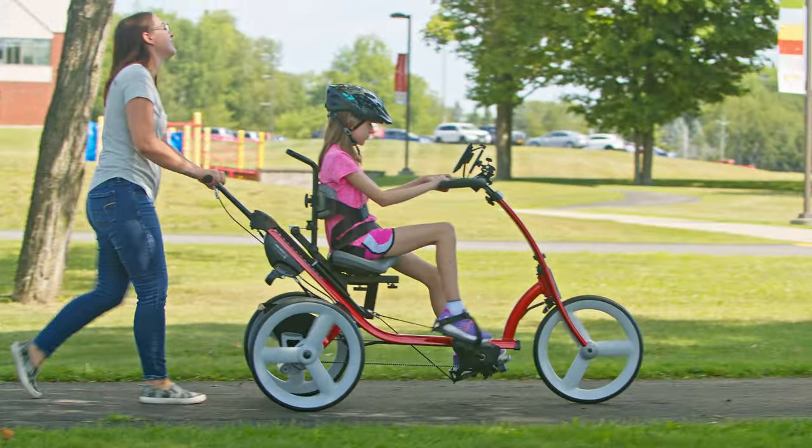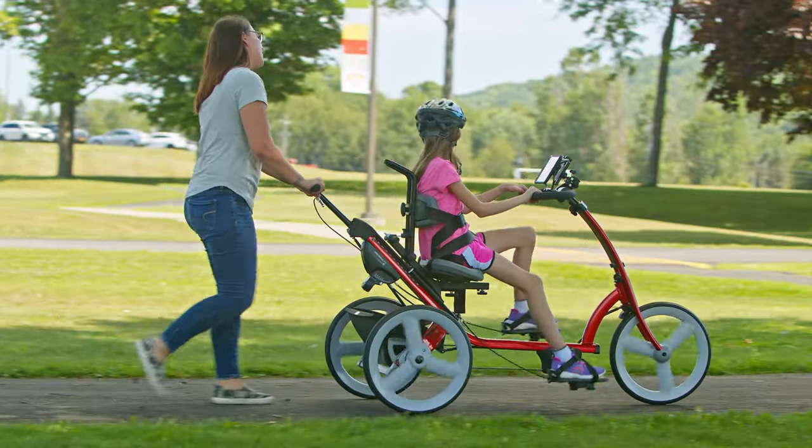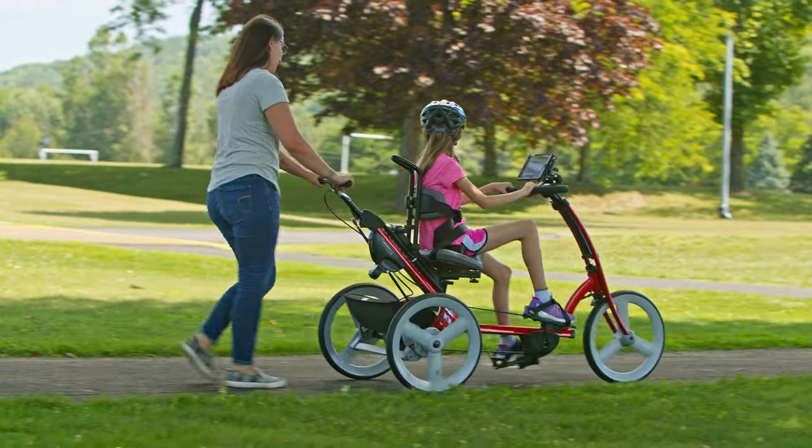The pedals are direct drive with a one-to-one gear ratio. If the rider can't pedal on their own, the caregiver can push the tricycle to get the pedals rotating for passive range of motion, progressing to active assisted and active range of motion.